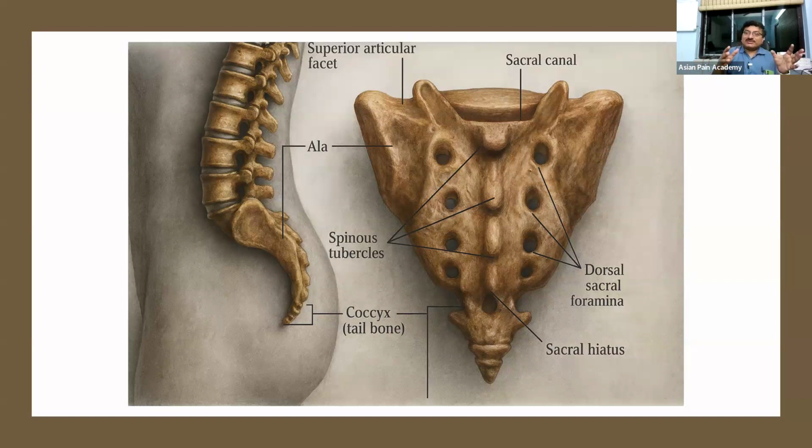So in short, we sometimes say in fluoroscopy, we see the stems. If you're looking at a jungle, we see the stems in fluoroscopy, and in ultrasound, we only see the superficial contour. In the same way it is said, fluoroscopy shows you the stems, but ultrasound shows you the leaves. So here it is like that. We can see the undulation that is there.